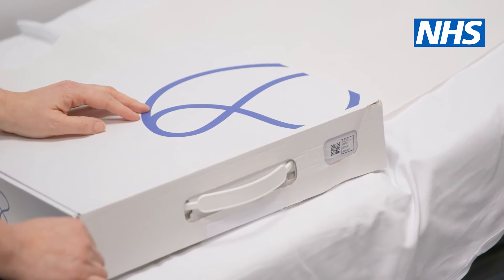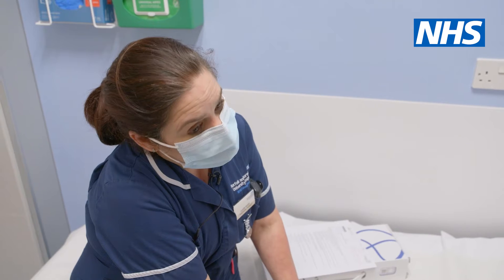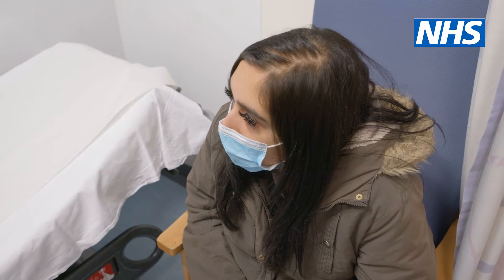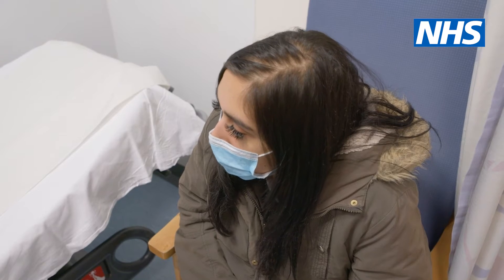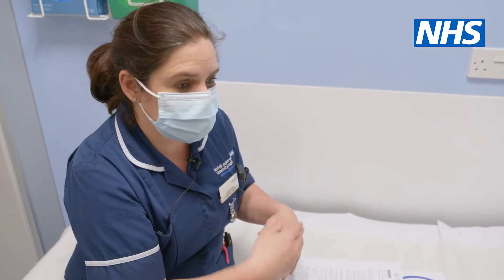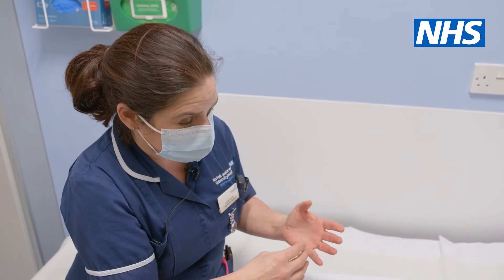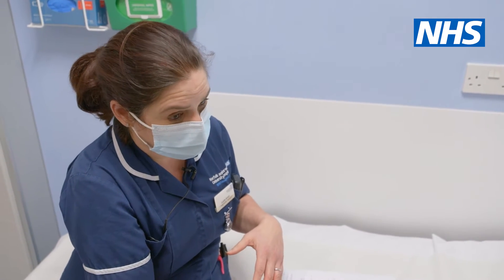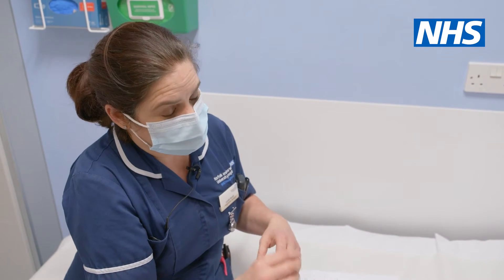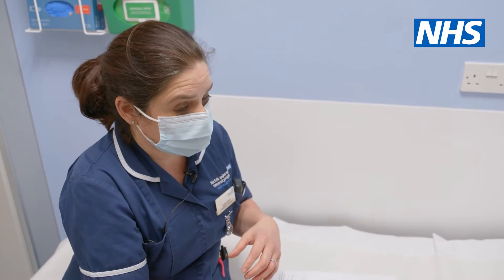The kit in here will monitor your heart rate, your oxygen levels, your respiratory rate, your skin temperature as well. So we can make sure that you're not becoming more unwell before you come in for your operation. There's a blood pressure kit in here as well. When you open it all up, there's a tablet and you just turn the tablet on. That tablet serves as a couple of different things — it'll help you set the kit up, but it also serves as a communication tool so you can get through to us. There's a button on there that says 'I'm not feeling very well' — you ring that and we'll answer very quickly.